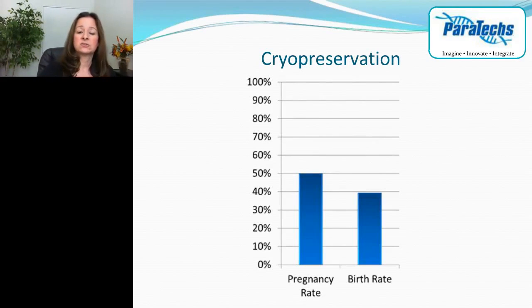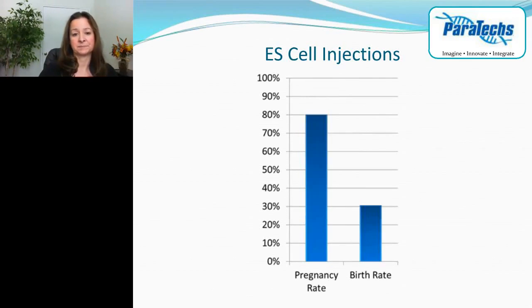NSET can also be used to transfer cryopreserved embryos. Here, cryopreserved B6C3F1 one-cell embryos were cultured to blastocysts in KSOM media and transferred again to 2.5-day pseudopregnant CD1 recipients. The transfer of the cryopreserved embryos resulted in a 50% pregnancy rate and a 39% birth rate for this experiment.